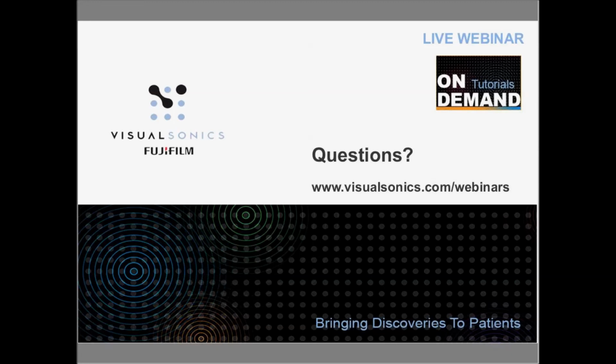Any influence with gels? You know, you have shadowing and those kinds of situations, especially with different types of models. Is there any way, have you seen people use different types of gels? This is one of the questions that came through. If that has any effect?